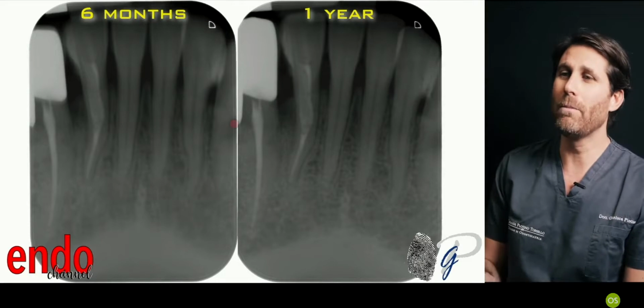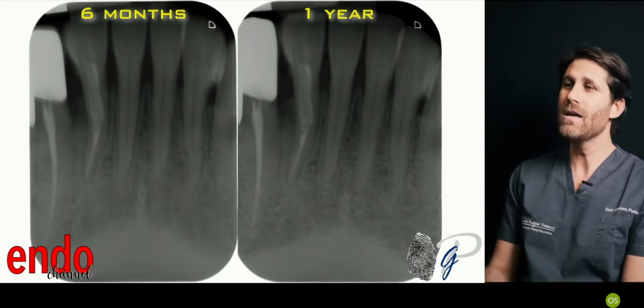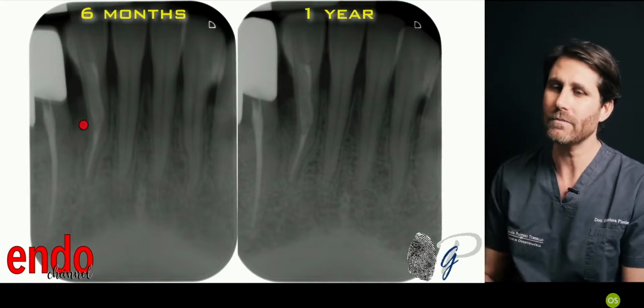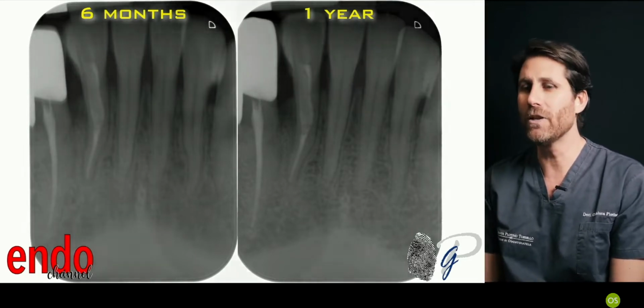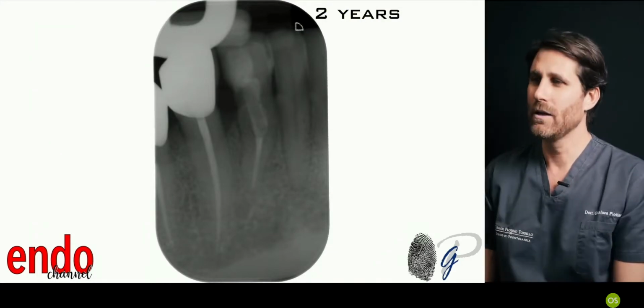Of course, I put a post in these cases to try to strengthen the tooth structure and the walls of these teeth that are very small and thin. And we have to give advice to the patient that this may be a problem for the fracture resistance of the tooth, that is, in any case, arrived at the 2 years control.